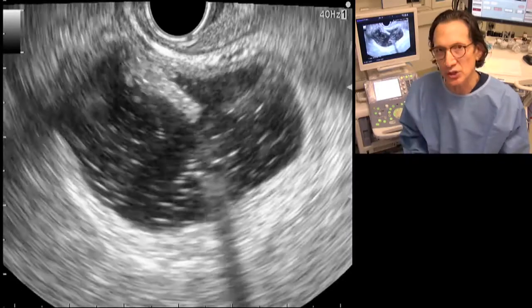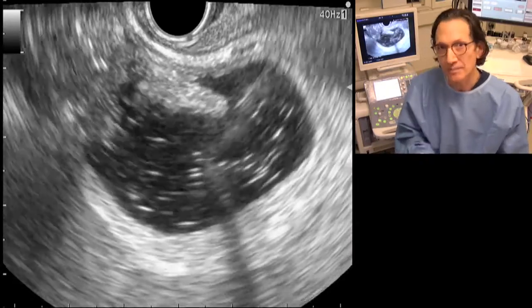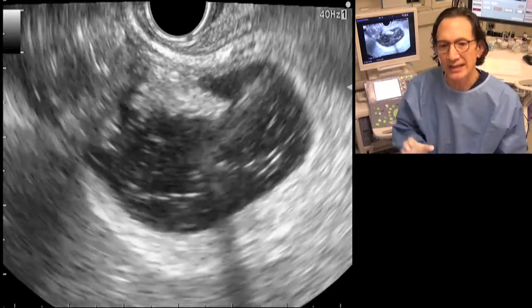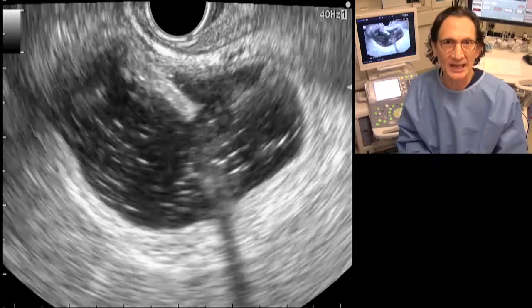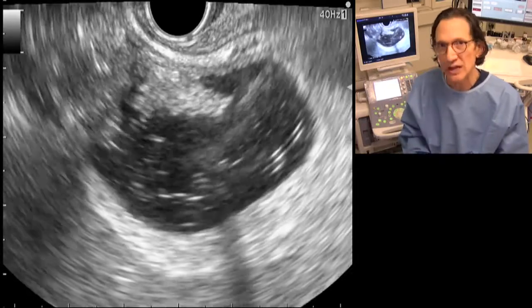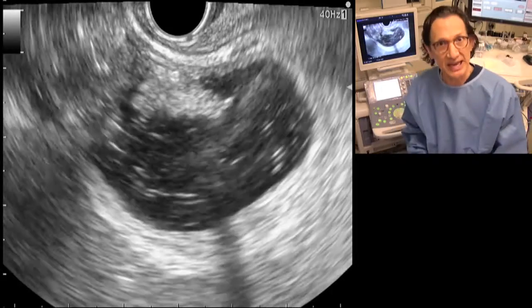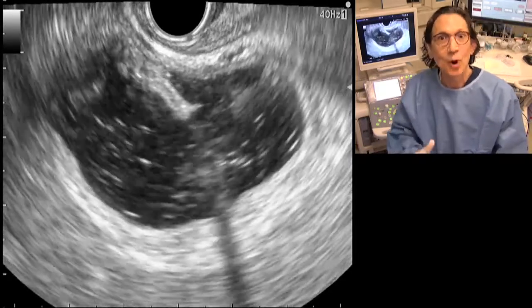Every time you exchange an instrument over the wire, you will get some leakage between the wire and the lumen that you've created with your access device, especially after you've dilated a tract and created a big hole. You're going to have bile leaking out, gushing out as soon as you pull out your dilating balloon, for example, or bougie, whatever it is that you might use. As soon as you pull that out to exchange it for your stent catheter, that's when bile leakage can occur. So we want to eliminate the over-the-wire exchanges. That is the Seldinger technique, and we want to eliminate that. So in a way, we are now going beyond Seldinger.